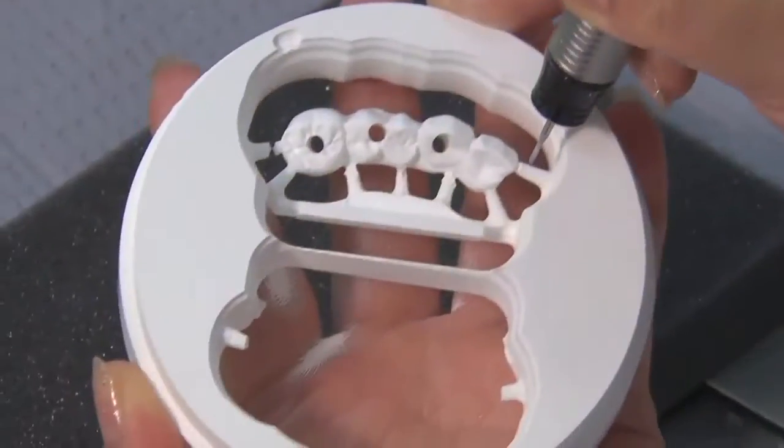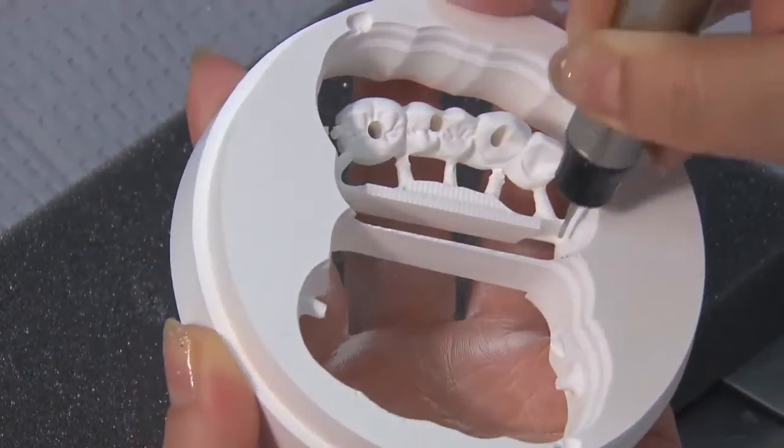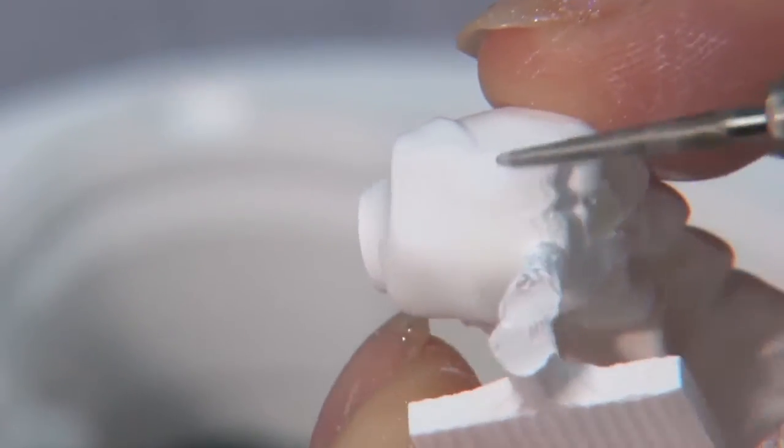After milling the Bruxer partial arched implant prosthesis, it is removed or de-sprued from the zirconia block. A handpiece is used to remove the sprues from the appliance.